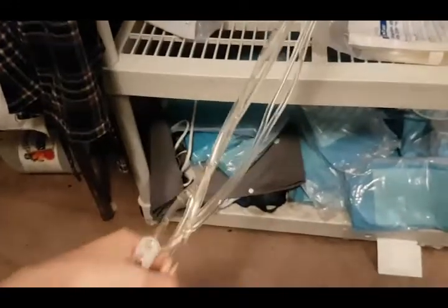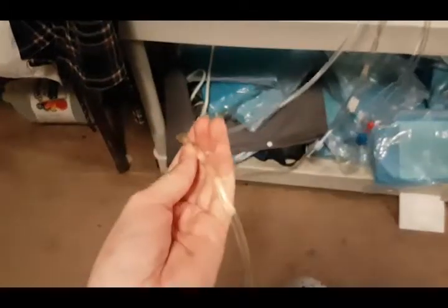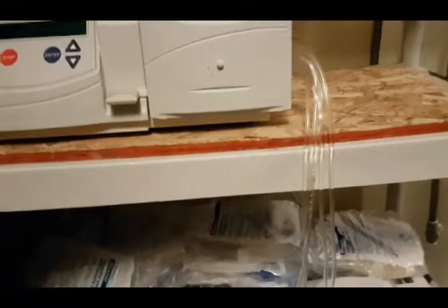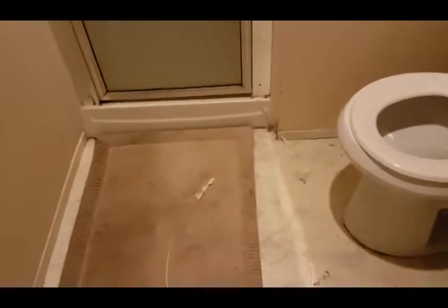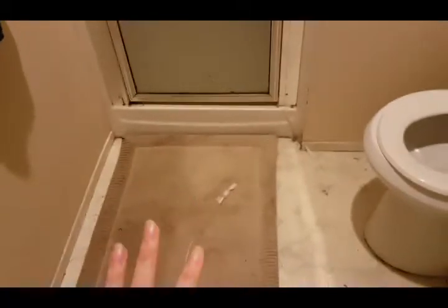Now, something you may ask is, okay, all this stuff goes into your body, well, how does it come out? I mean, don't you gain a lot of weight and everything? Well, there is something called a dwell time, and there's a certain amount of time where the solution will dwell in your abdomen, and once that is over, the machine will have it come all the way out of your body. My dad lets the last of it drain into the bathtub, which is pretty economical, and you don't have to flush the toilet all the time, but you do have to watch your drains because it is a dextrose solution. It can make it kind of sticky and gunky, and it can plug your drain. So make sure you keep that clean.